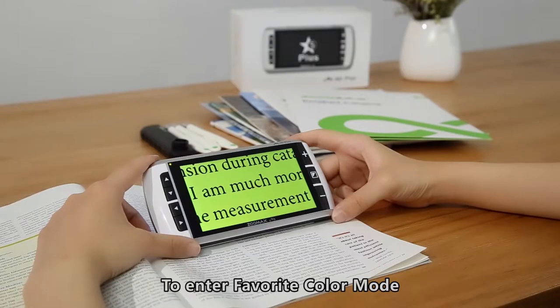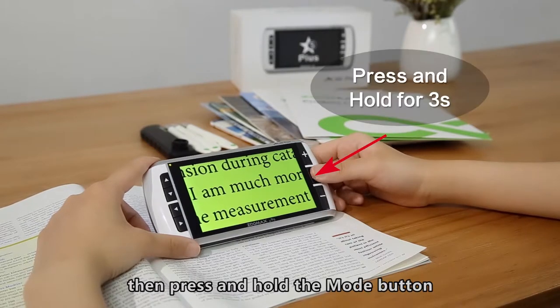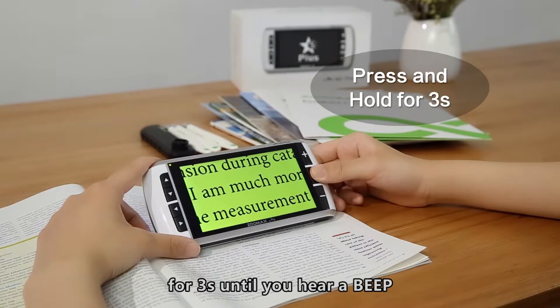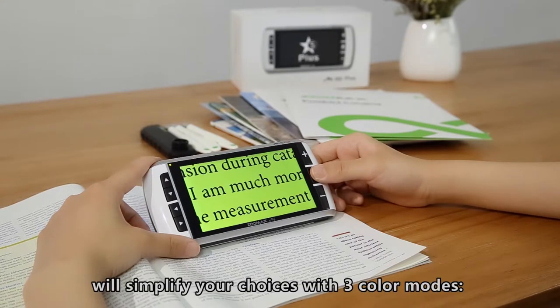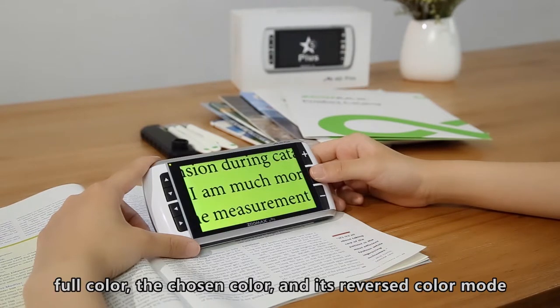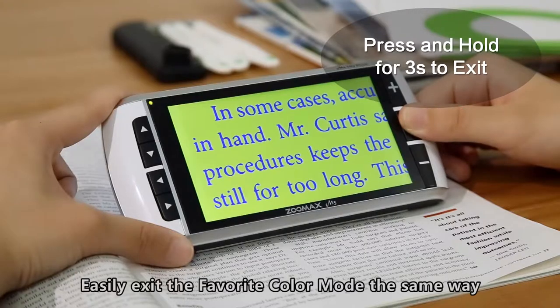To enter favorite color mode, first choose your favorite contrast color. Then press and hold the Mode button for 3 seconds until you hear a beep. The favorite color mode will simplify your choices with 3 color modes: full color, the chosen color, and its reversed color mode. You can easily exit the favorite color mode the same way.